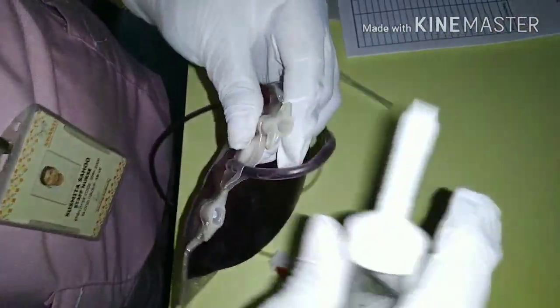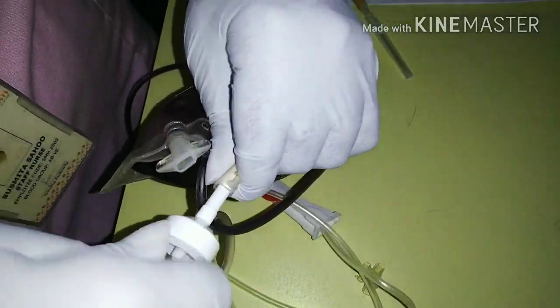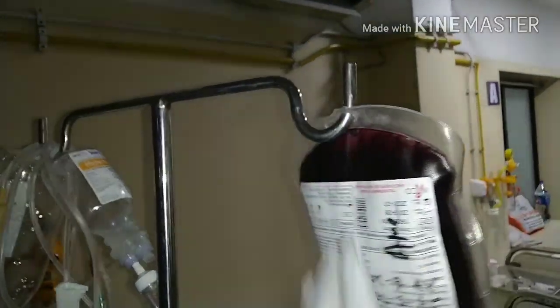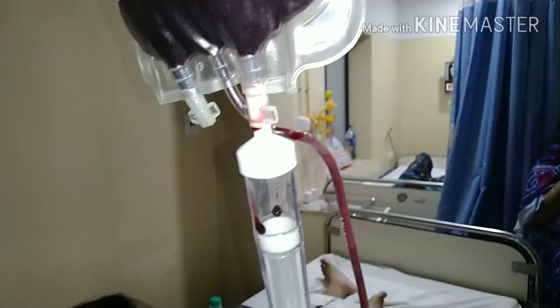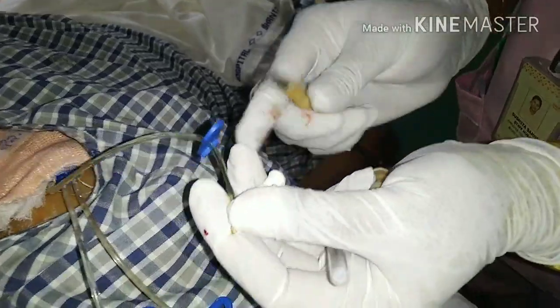After verification of the details of the blood bag, it is now ready to be transfused. The nozzle should be twisted and the blood transfusion set introduced. Then you hang the blood bag on the stand and make the chamber air-free — no air should be present during transfusion.